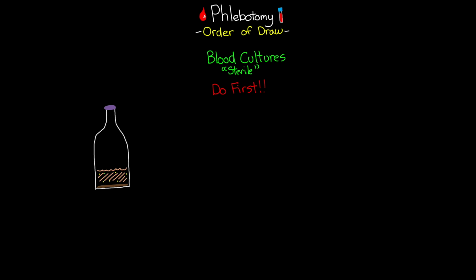And even more importantly, there's another chemical that's in here, and the sole purpose of this chemical is to reduce the natural bactericidal action that's normally present in the blood itself. And so it does this by stopping complement, and this slows down the phagocytosis and really prevents the killing of the bacteria by the blood.